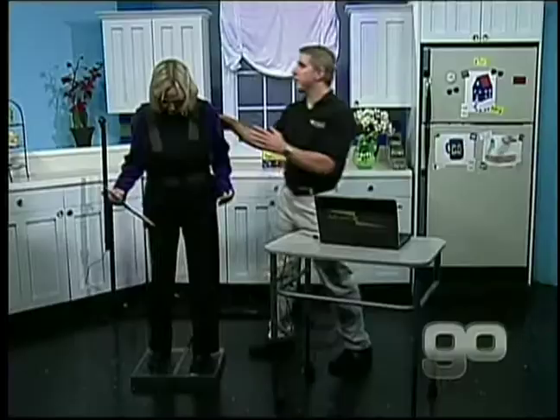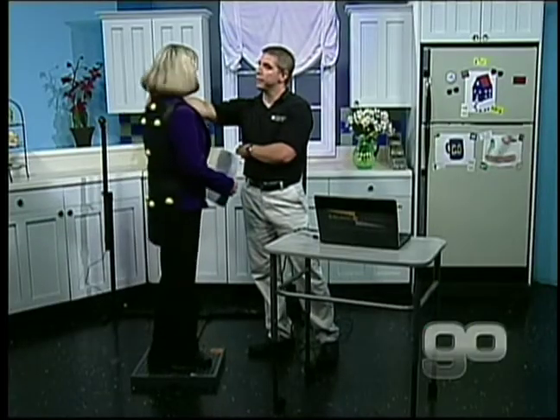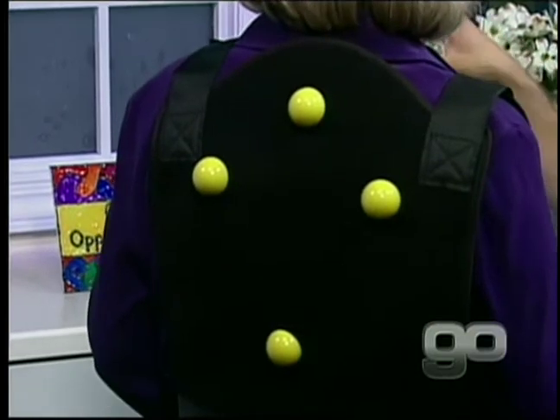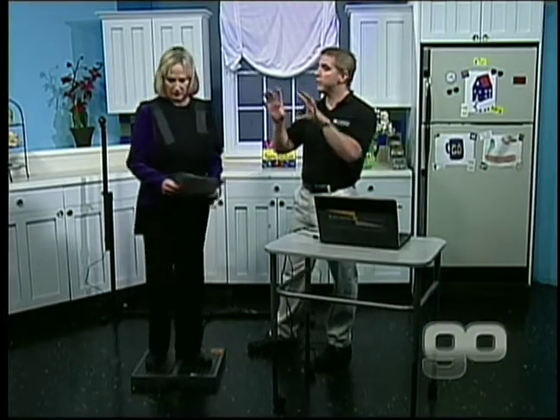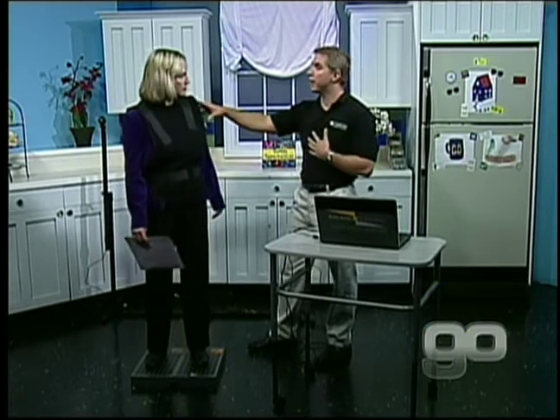So how can you test that? How can you tell someone's likely to fall? That's a great question. Gosh, I wonder why I'm all dressed up, right? We at NovaCare Rehabilitation utilize special tests and equipment like this to assess a person's balance and likelihood of falling. On the back, we have these yellow buttons. These buttons are picked up by the cameras, and the cameras go to this computer here. Based on that, we can tell how your thorax, or your upper body, is moving.